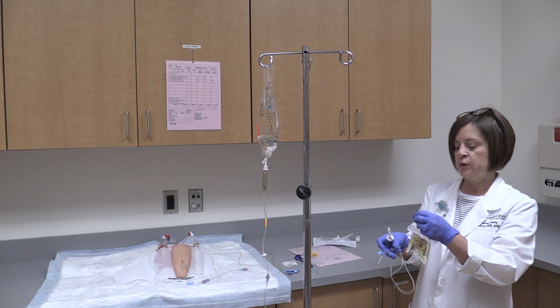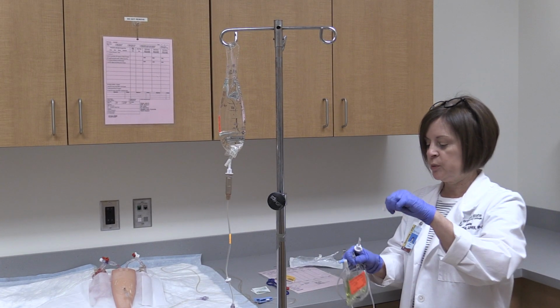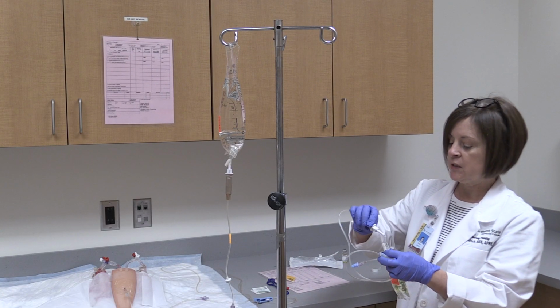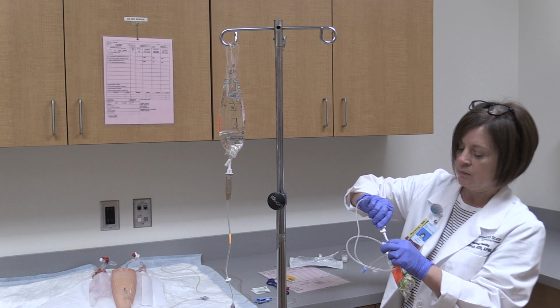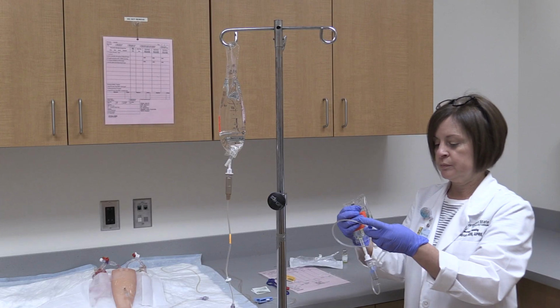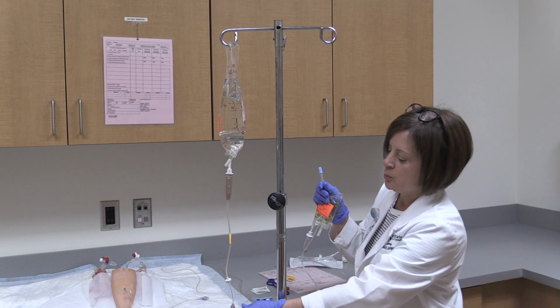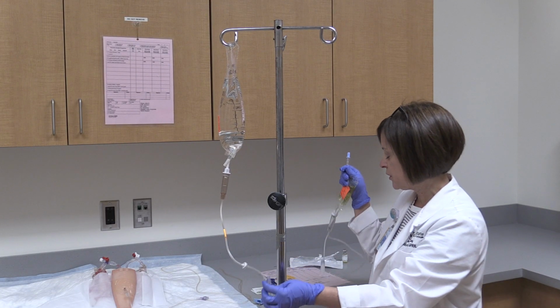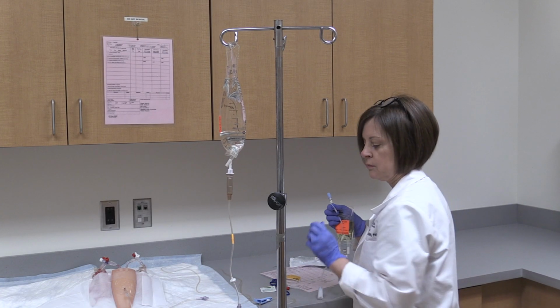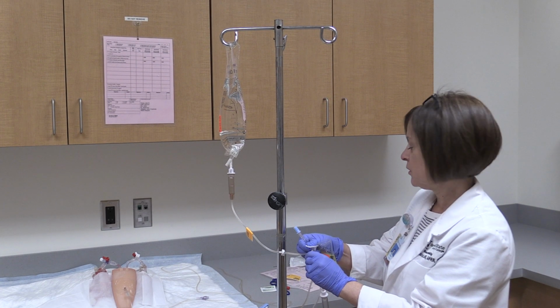At this time I'm going to go ahead and remove this cap and remove the cap from my tubing, making sure that I'm not touching any part that's going to go into the bag because that needs to remain sterile. Push that in there. And then I'm going to connect my secondary tubing to the primary tubing at the top port. So I want to take an alcohol swab and clean that off. Again, 15 to 30 seconds.